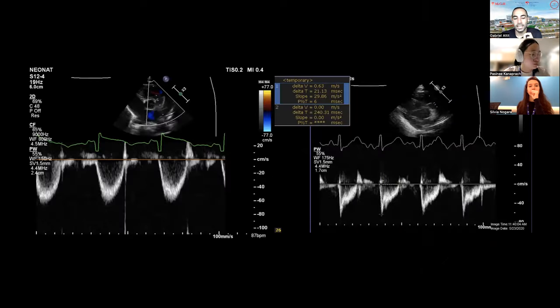It's just recently that the TNE guidelines have recommended to do two samplings, one at the RVOT and one at the pulmonary artery. So we may start doing that, but you're going to see in a lot of our scans at NeoCardiolab that we've done a few samplings, and most of the time at the level where we do the cardiac output. But that's important: it's how you describe it in your paper when you're measuring. What's important is always to be consistent. But yes, it's true that adult guidelines, which have the most data on the use of acceleration time, have done it inside the pulmonary artery at the tip of the pulmonary valve. Okay.